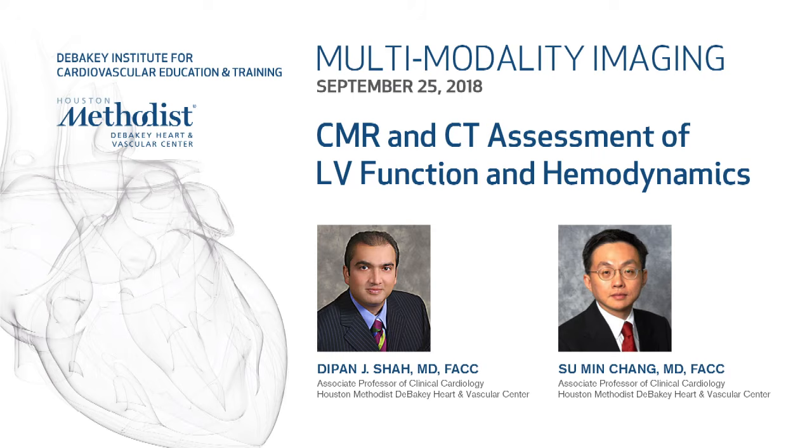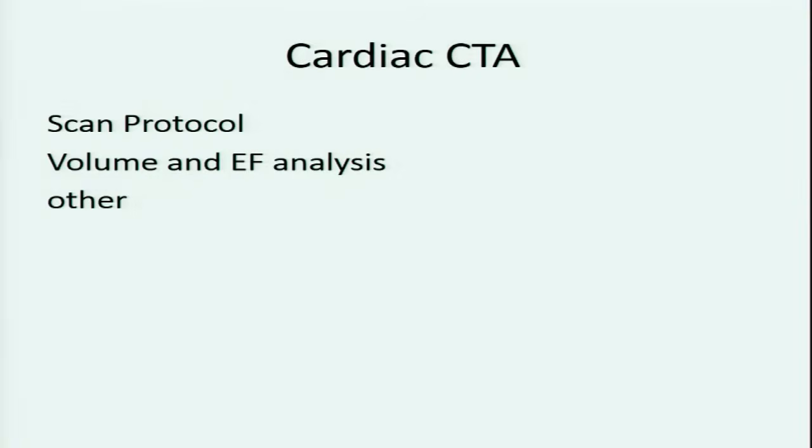Okay, just real quick. Obviously, cardiac CT is almost never your first choice for LV function assessment, but on very rare occasions, I think we use CT. But first, instead of going through all the potential pitfalls and advantages of CT, I think it's important for the fellows to understand first what the scan protocols are, okay? Because oftentimes, a physician gets a CT scan and might ask you mostly for the coronary or the cardiac structure, but you need to be able to understand the scan protocol you use.